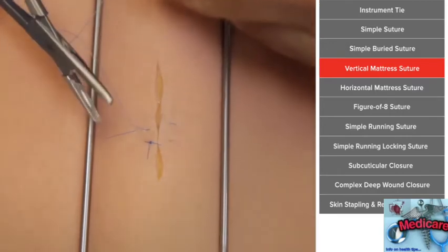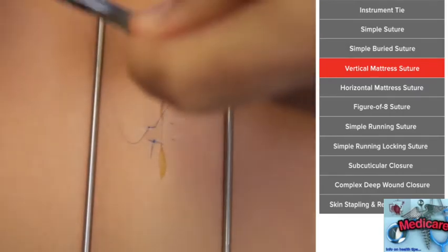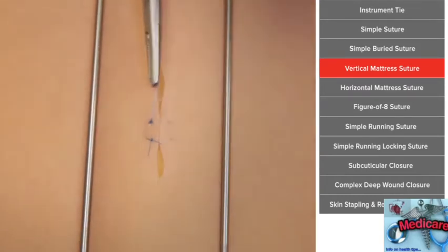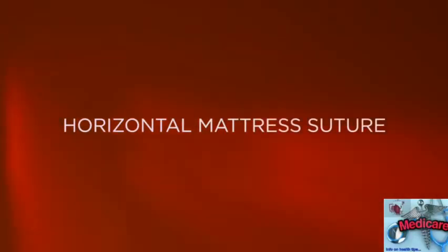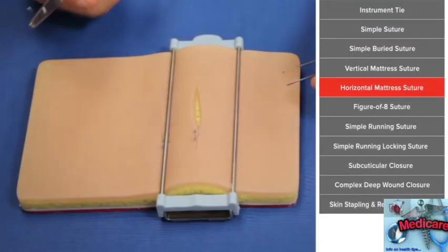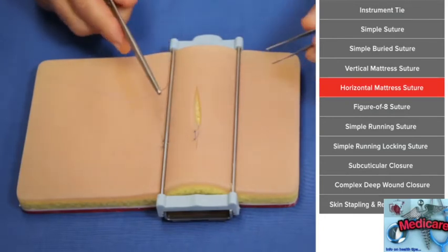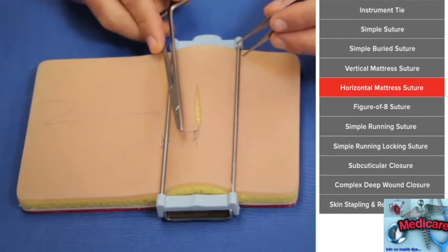So this is important when we are doing different types of deeper closures, and certainly wounds that are traumatic and maybe have edema and are swollen and under a lot of tension. Now this type of suture is going to be part of your armamentarium. Now sometimes you can change it to a horizontal position. So these are all in the same line, and hence the term vertical.